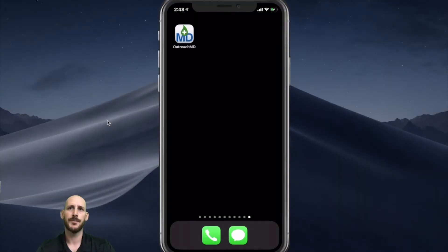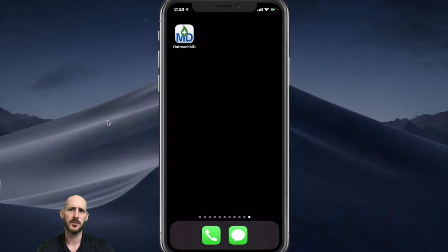Hi, Ross Cantor here. Today I'll be showing you our mobile application, OutreachMD, which provides clinicians with instant access to results on iOS and Android devices. It can be branded and listed within the respective app store for your laboratory, provides critical and new notifications, and is HIPAA compliant.